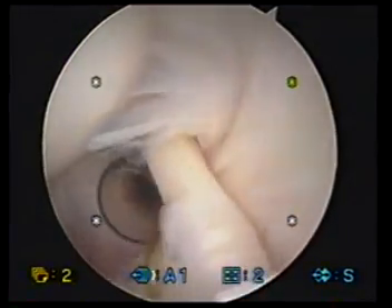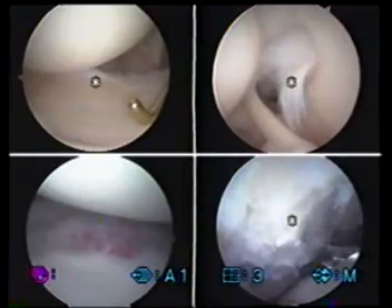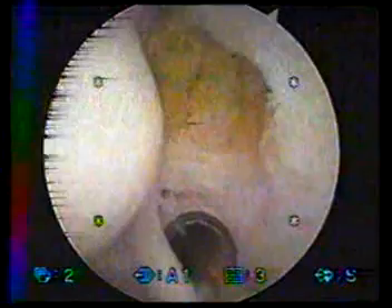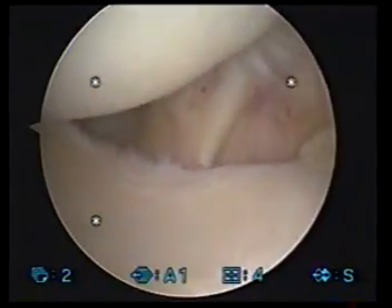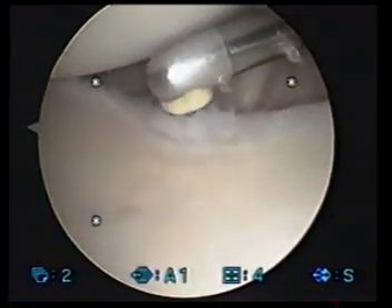The undersurface of the rotator cuff has a tear on it right there. You can clearly see the tear. That's what we're going to be fixing for you. We're going to start cleaning that up first and get that ready for repair with the shaver. That's the undersurface of the rotator cuff right there with the tear. We're going to sew that back together for you by looking from the other side. We're also taking care of this minor amount of radial fraying.